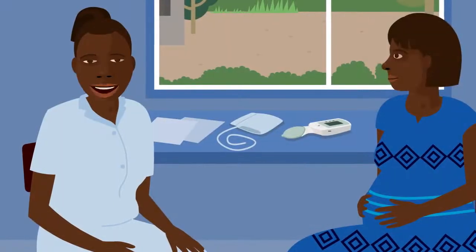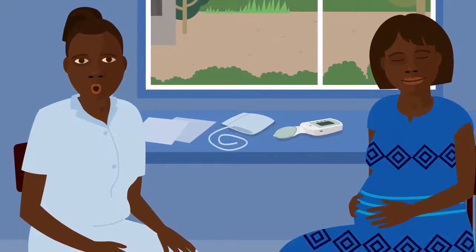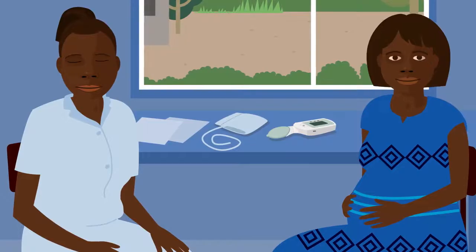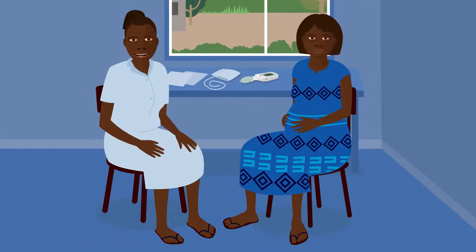I'll begin by showing you how to use the Cradle VSA. Before the test, if the woman is well, she must rest for five minutes. Then she must sit with her back supported and her feet flat on the floor.